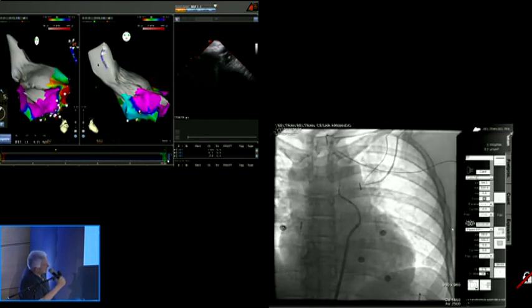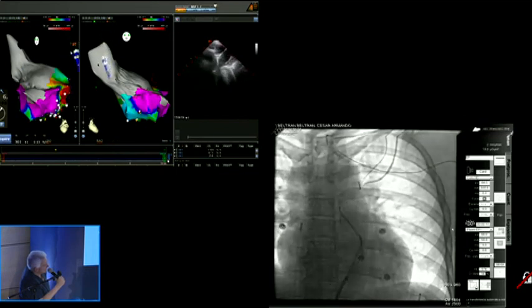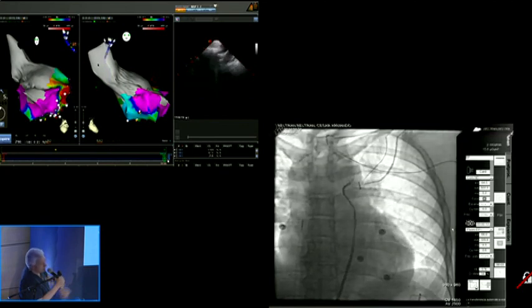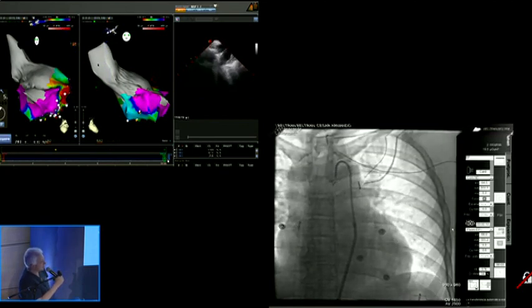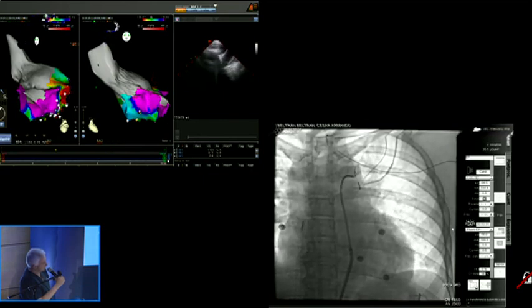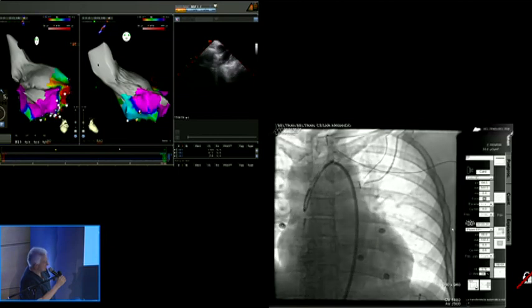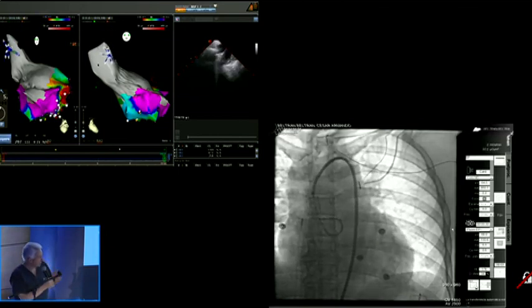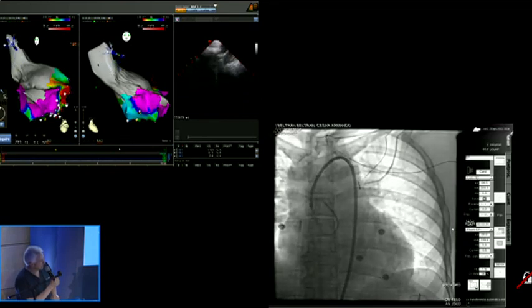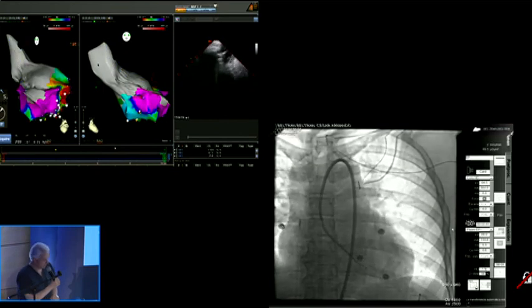You're gonna okay. There. Yeah. So he's trying to make a loop. Yeah, there it is. Okay, that's good. Okay, yeah, advance. That's good. Come on. No, so if you rotate, it will do it. Just, yes. Okay, there it is. Crossing. You're through. Okay, perfect.